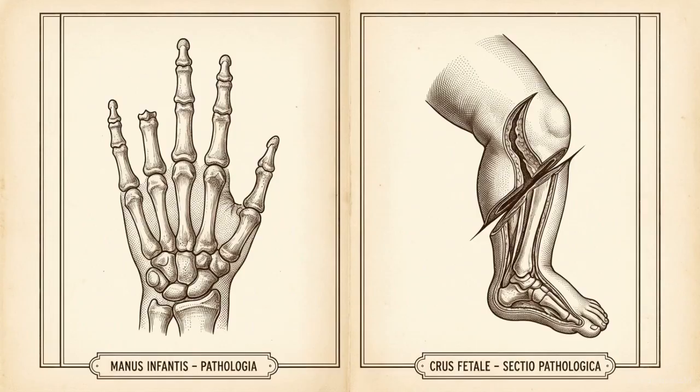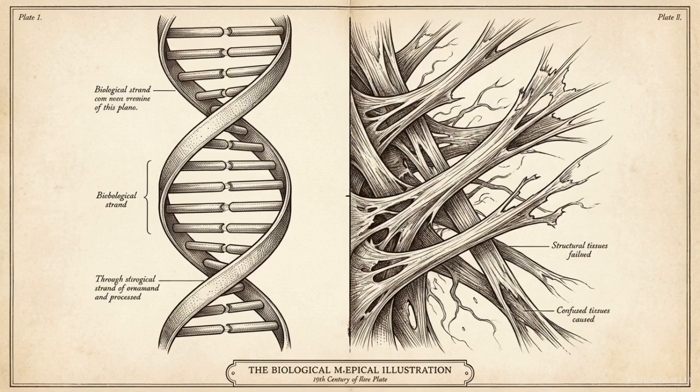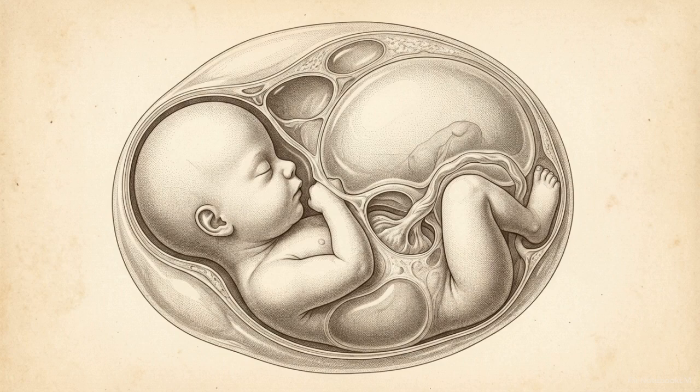On imaging, this presents as amputated features alongside a completely normal skeletal survey. In some cases, the entangling bands themselves can be visualized directly on the ultrasound. The amputated limb is a localized environmental injury caused by boundary failure. It occurs entirely independent of the fetus's intrinsic developmental programming. Fetal hydrops is a catastrophic state of systemic fluid overload.